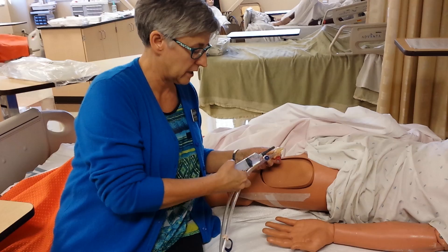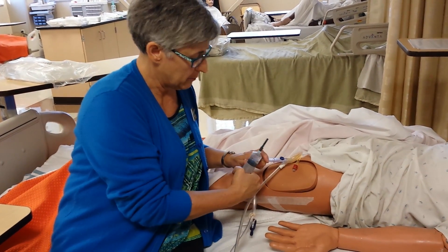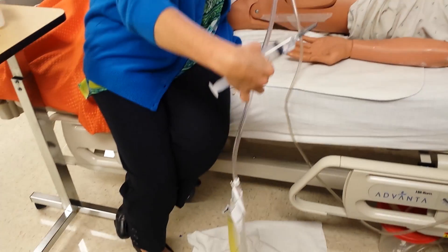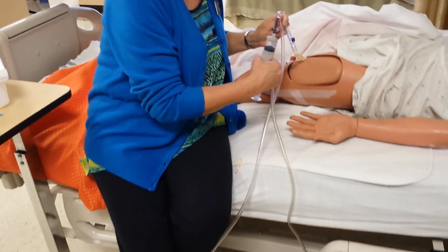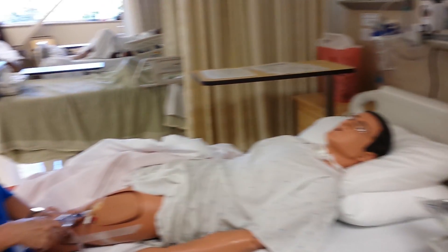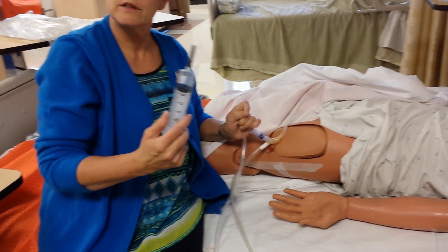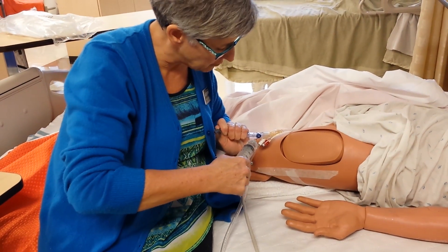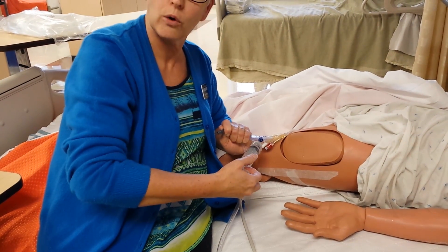You've got your syringe with your sterile normal saline. You're clamping off the tubing that's going away from the patient into the collection chamber — that's clamped off — and my CBI is clamped off. So I want both of those things clamped, and then I'll do my irrigation with a blunt needle, large bore — this is like an 18-gauge blunt needle. So that's a closed irrigation.